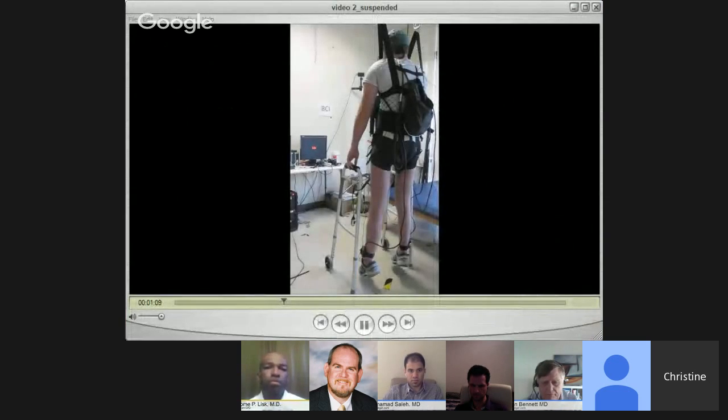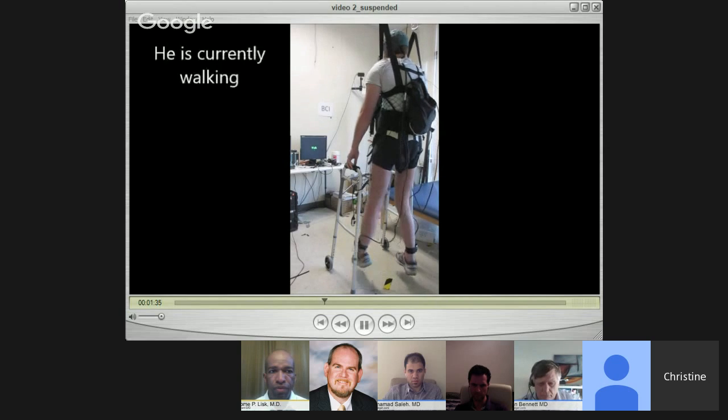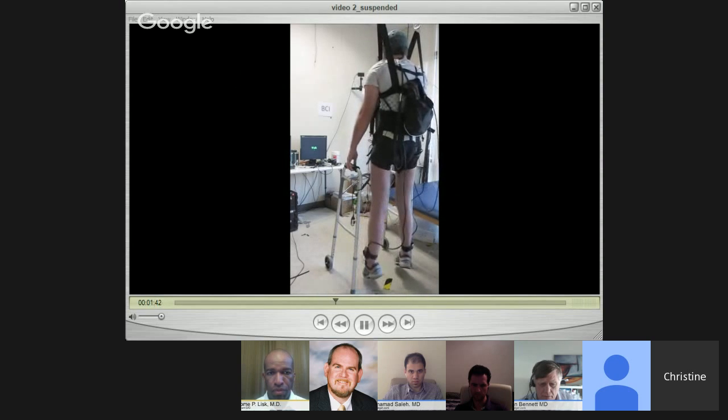Yeah, it's very good. So what you're seeing is he's suspended off the ground. He has his FES pads mounted on his quadriceps and his tibialis anterior. Turned out he did not need gluteal muscle stimulation. He was able to sit and stand and have good enough posture without it. And you can see in the back behind him, that's a little backpack where the amplifier and batteries and device controllers were mounted. So now he's being told to think about walking, and what you can see is his legs are being stimulated in a cyclic-like pattern to allow for him to walk again.